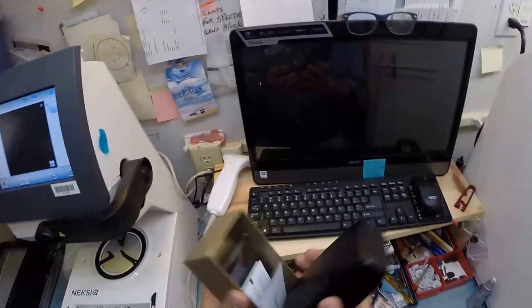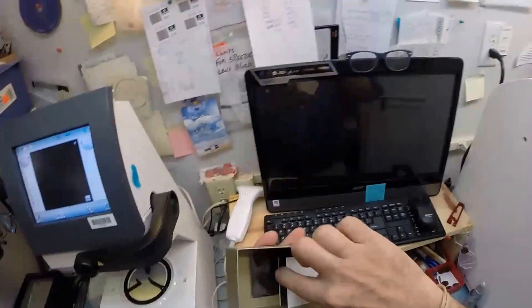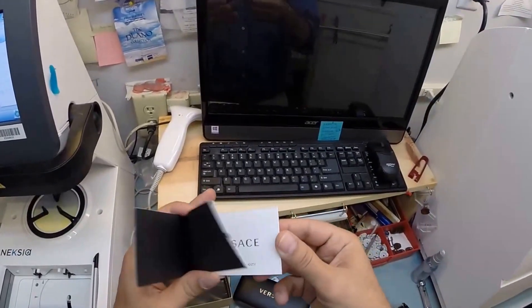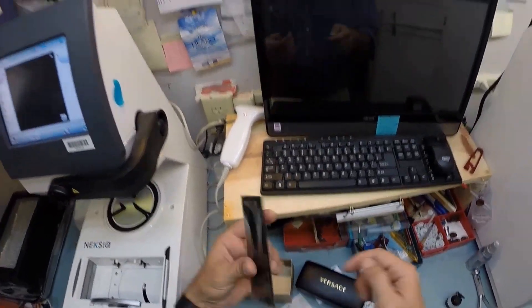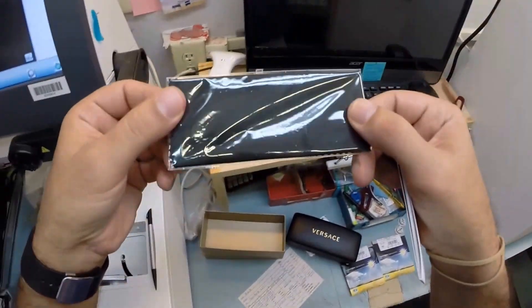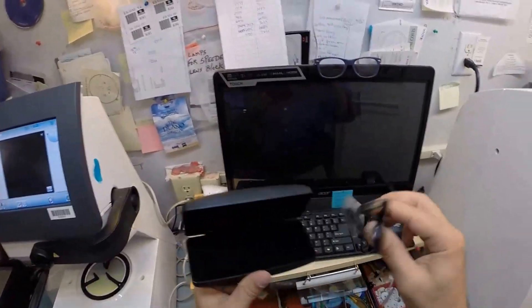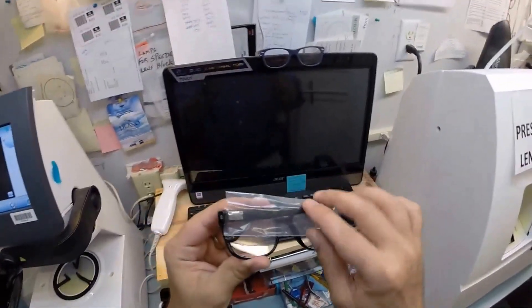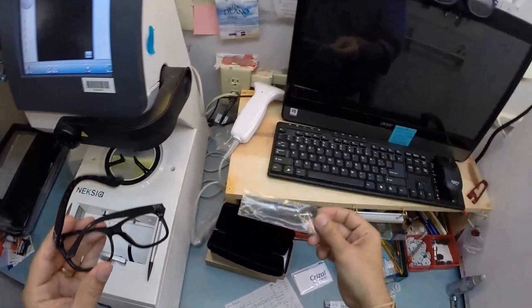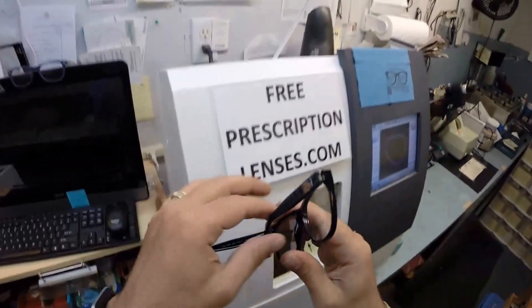I'm going to take everything out of the original packaging as Versace sends it to me. Of course, your Italian leather Versace case with a little styrofoam on there, your Versace card of authenticity where you can register your product with Versace, and of course the Versace cleaning cloth. Hopefully you can read that and there's not too much glare. So let me take out the star of the show, the main attraction. It comes with a little plastic sleeve on the left temple to protect the temples from rubbing together while being shipped from Italy. These are the model 3199 color GB1 in the 55 eye size.